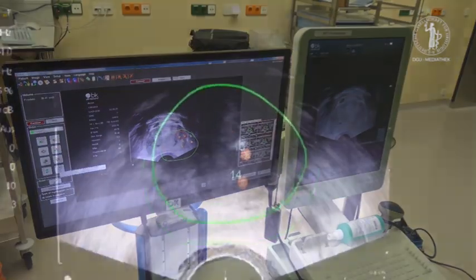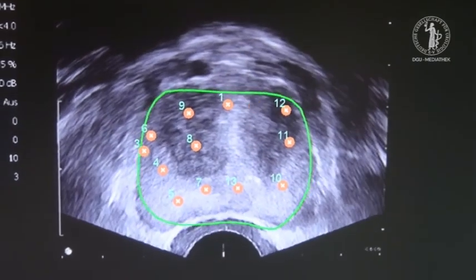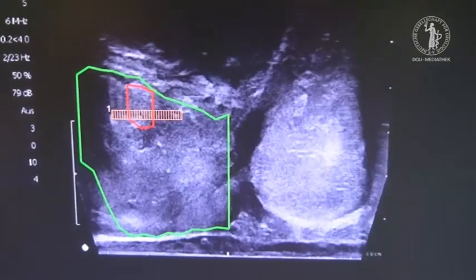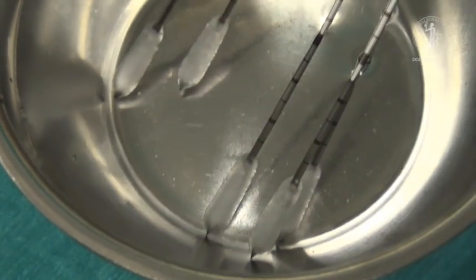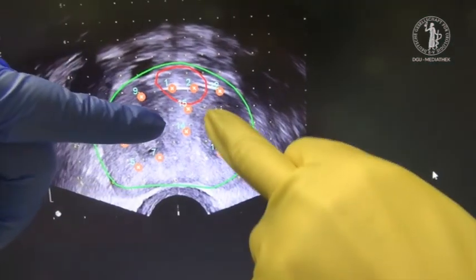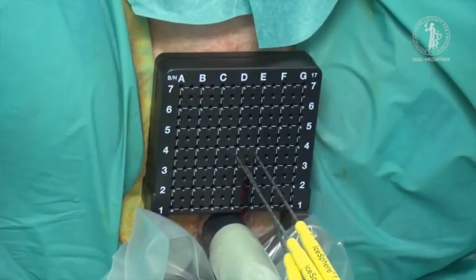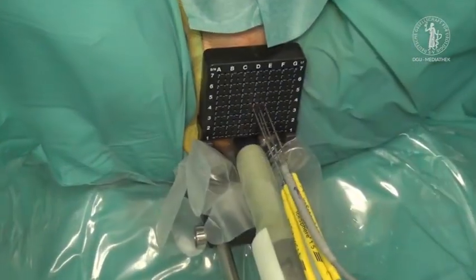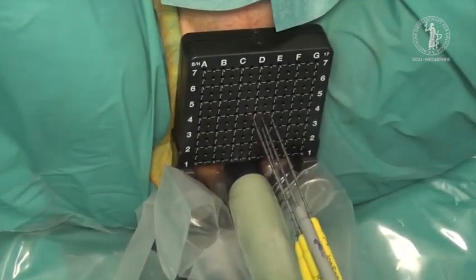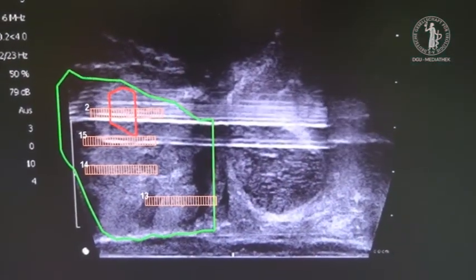Software-based MRI ultrasound fusion of the prostate images is performed until accurate matching is reached. Cryo-needles are tested outside the patient, followed by placing them into the tumour-bearing lesion under ultrasound guidance within a maximum distance of 1 cm. In this case, three cryo-needles were inserted. One multithermal sensor was placed directly within the lesion, and a second sensor was placed in the Denonvilliers' fascia for monitoring the rectal temperature.